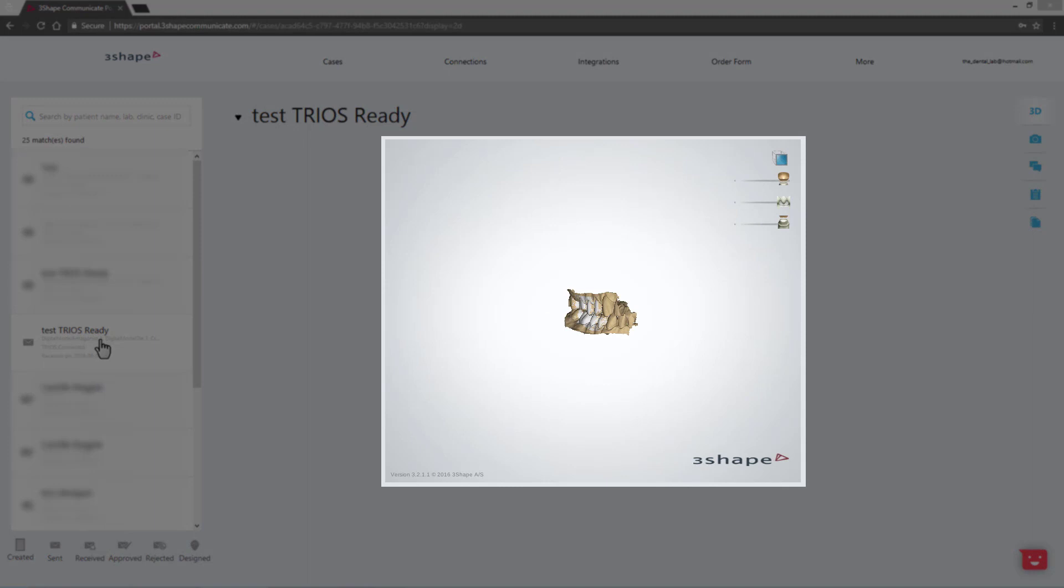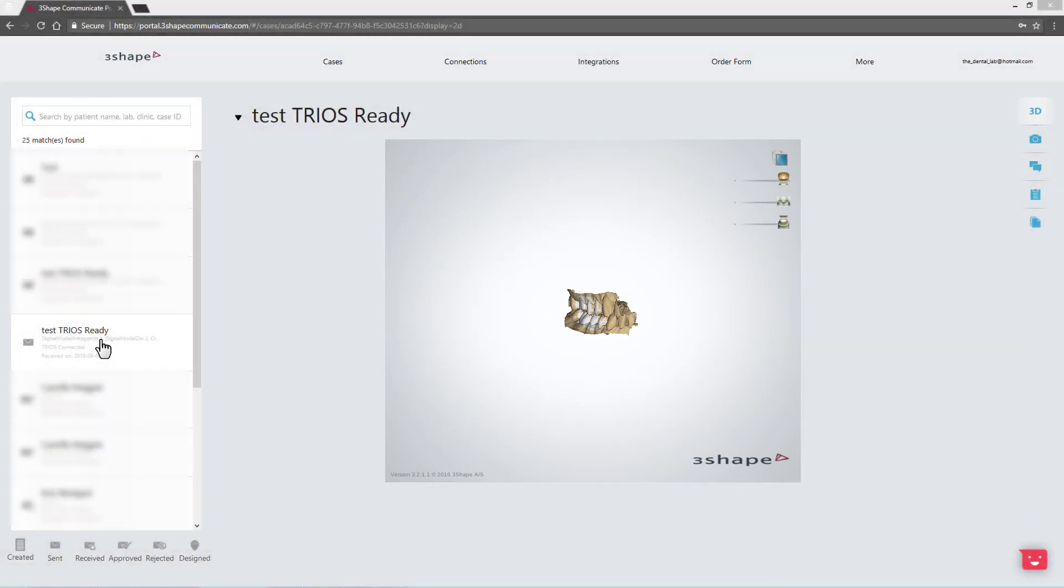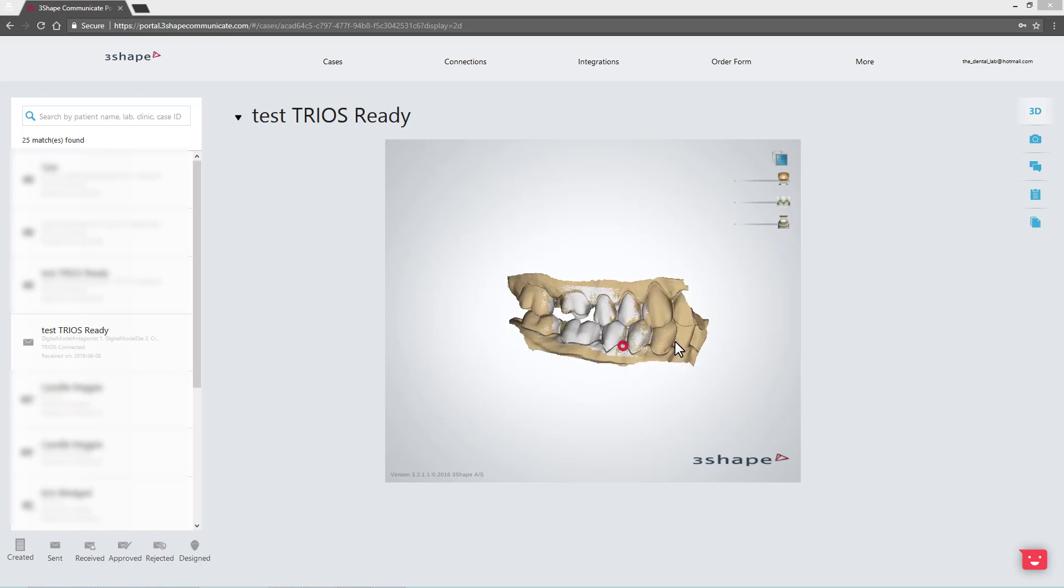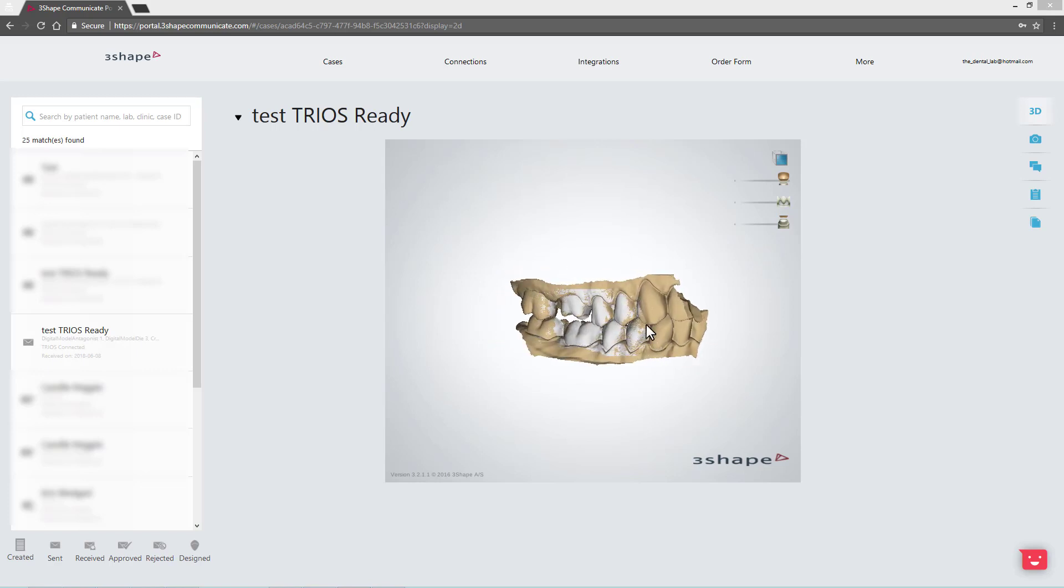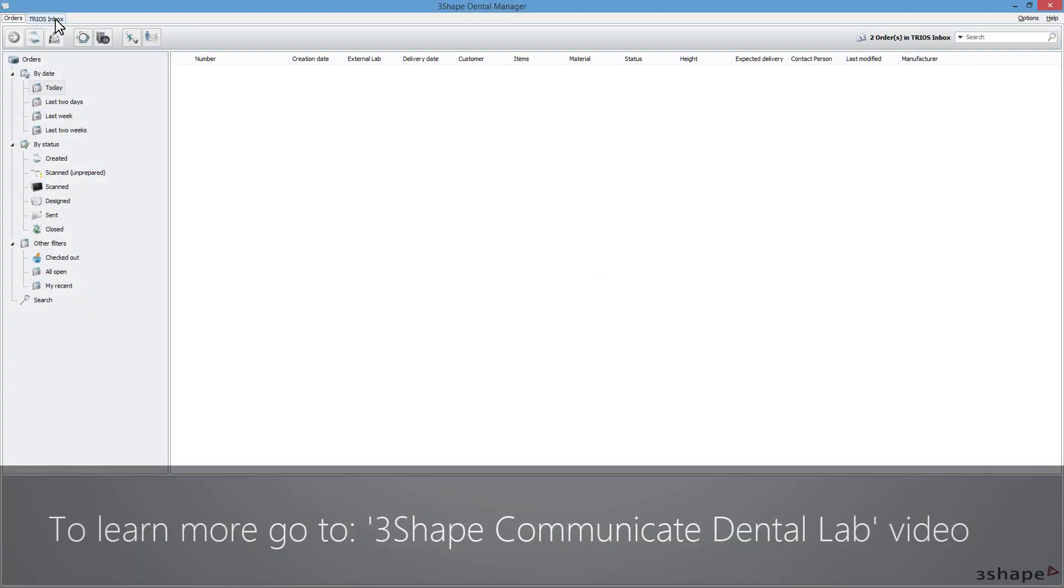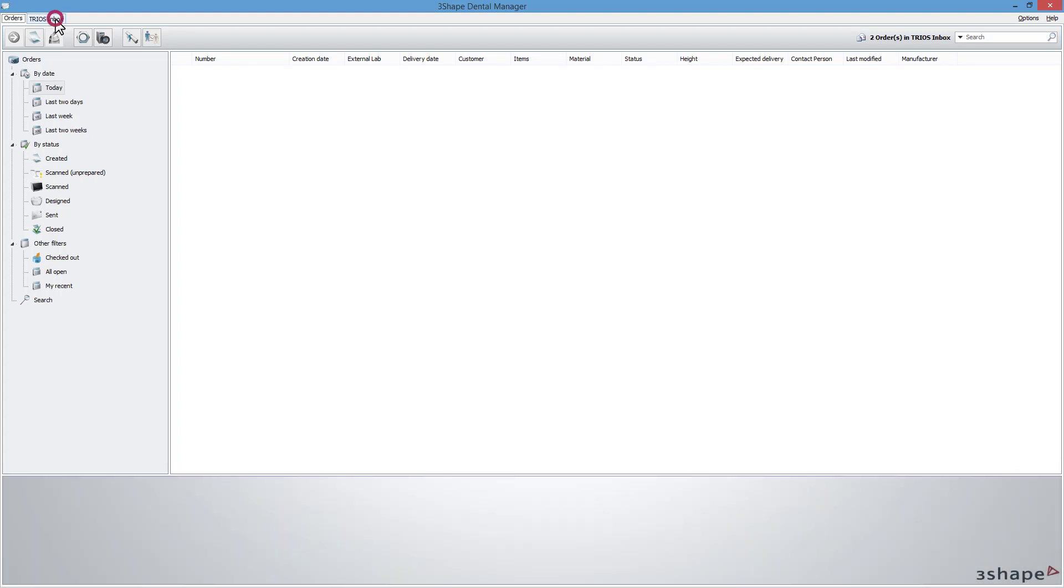In the middle window, you can investigate the 3D view of the scan. Remember that you have to integrate your TRIOS Inbox in Dental Manager with the 3Shape Communicate account of your lab. Enter the TRIOS Inbox tab in the Dental Manager and accept the order.